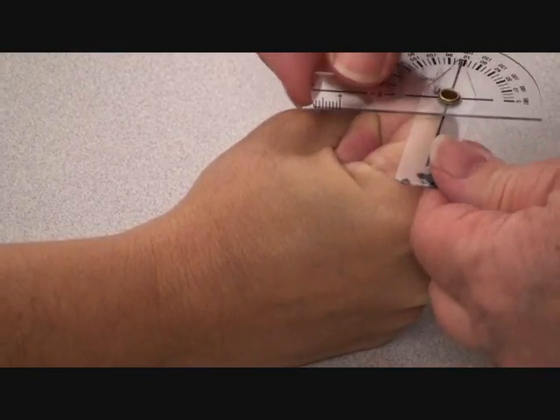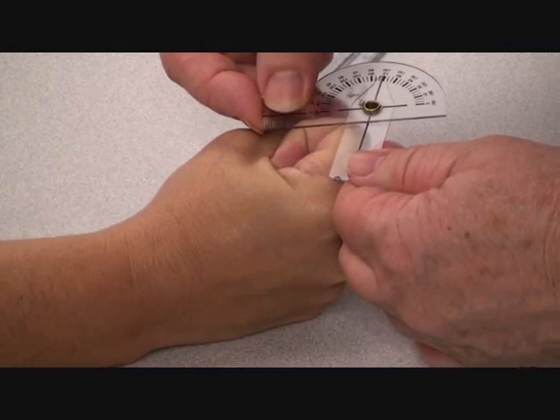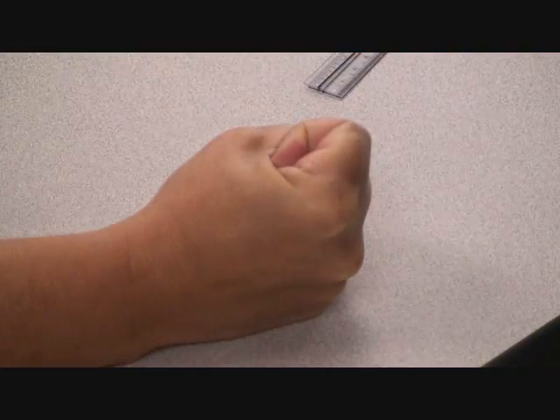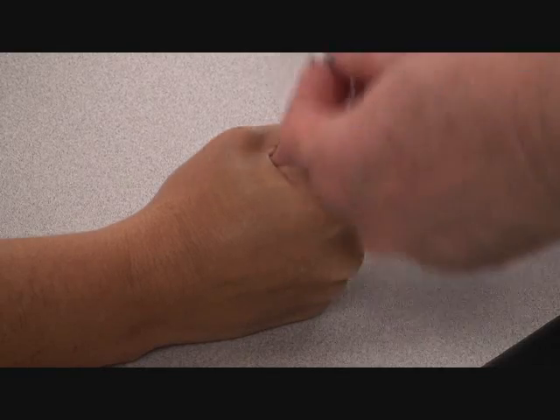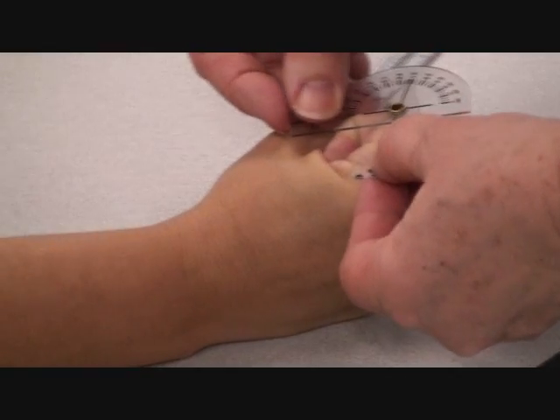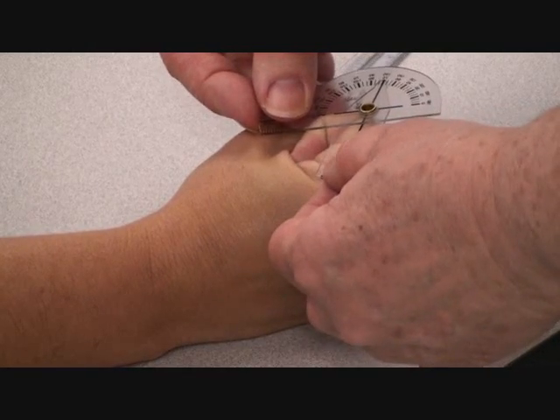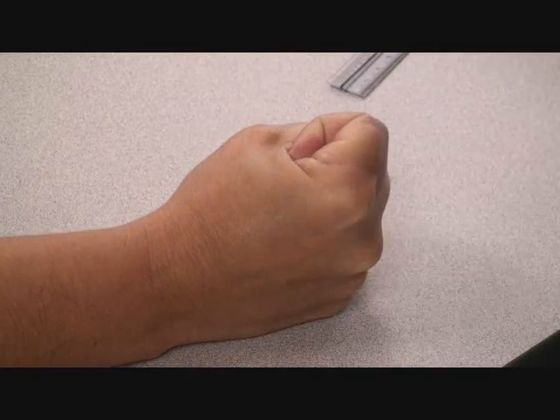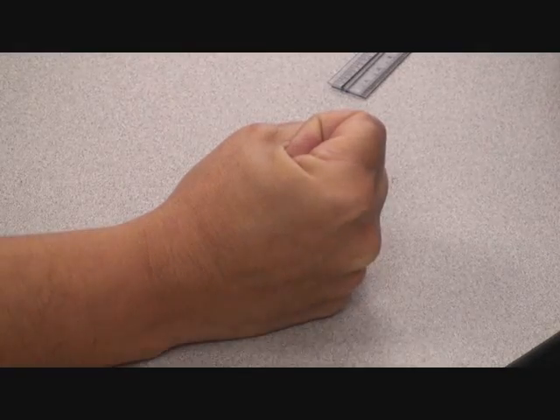So let's see if I go silhouette with the black lines, I've got about 107. If I go right over the top and kind of try to center that over the bones, I've got 105.